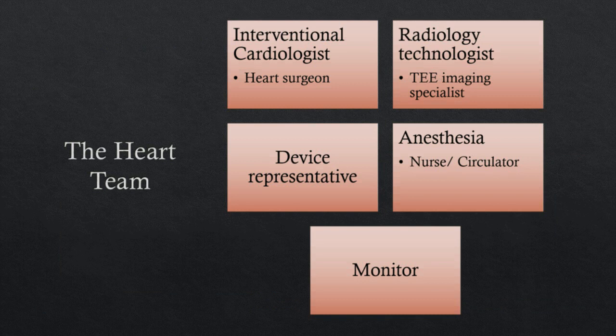The heart team will generally consist of an interventional cardiologist to perform the procedure, and in most cases includes a heart surgeon, as well as radiology technologists to assist with setup and scrubbing the case, a TEE imaging specialist for guidance, anesthesia in most cases, a nurse and circulator to help with the procedural care, a device representative to help with device questions from the team, and monitor personnel to document and follow hemodynamics.